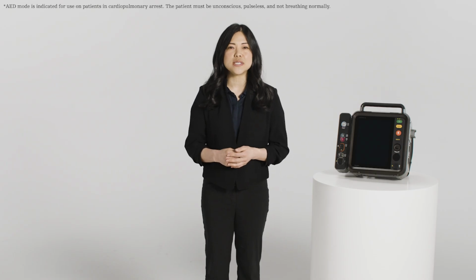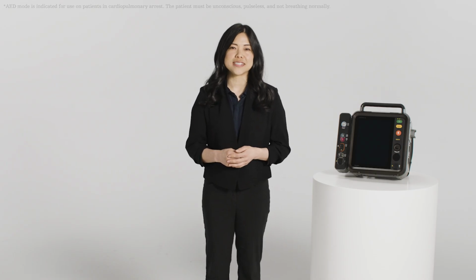AED mode in the LIFEPAK 35 monitor defibrillator provides a prompted treatment protocol and ECG analysis using our patented shock advisory system. Your LIFEPAK 35 may be configured with CPR Insight available in AED mode, and your device can also be set up to display the top 2 waveforms in AED mode or no waveforms displayed.